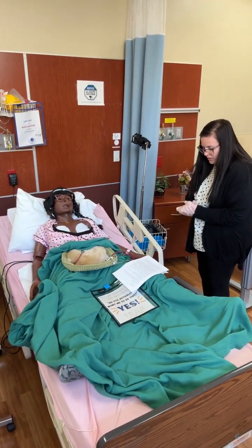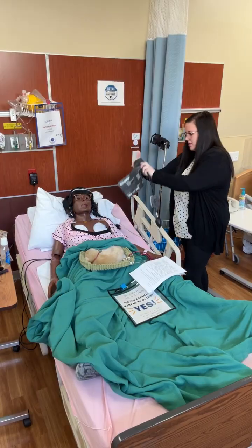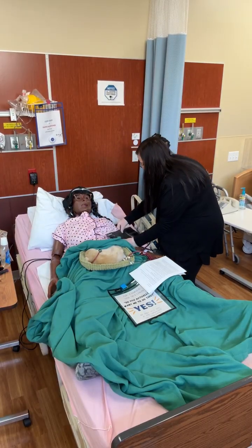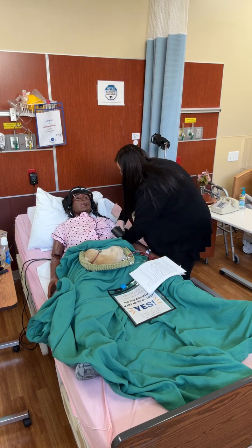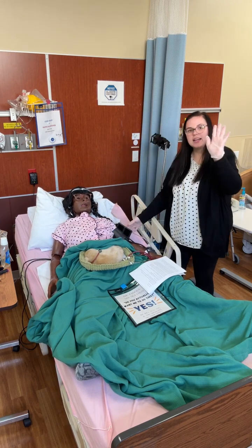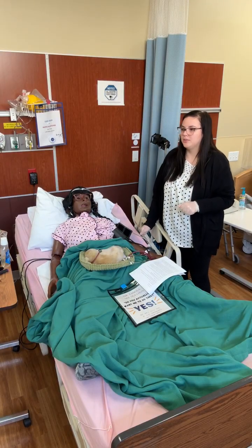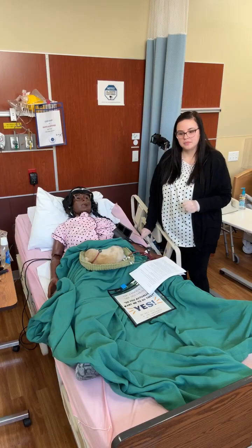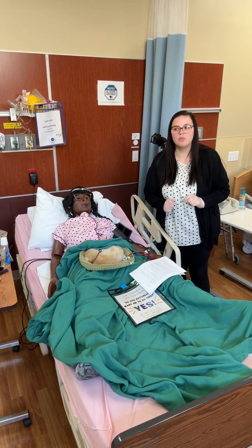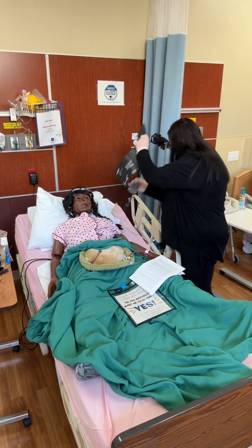So to obtain the blood pressure, you are going to grab the blood pressure cuff. Hi Carla, I'm just going to get your blood pressure. Put this on my patient's arm. And it's on there, so I'm going to say, sim question, what is Carla's blood pressure? Your blood pressure is 120/80. Perfect. So then I'm going to document that up on the whiteboard, 120/80. I'll take this off of you.